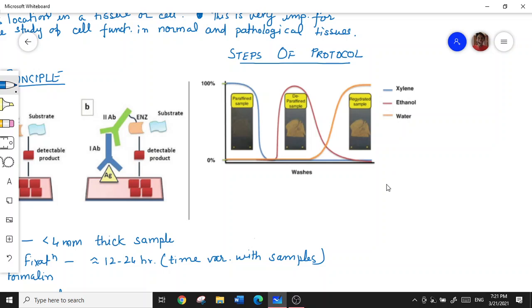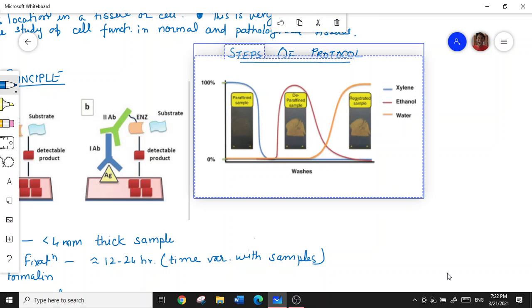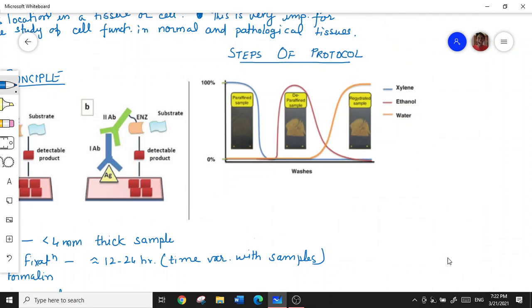So this is how we can check the presence of antigens, which are species specific, lineage specific, strain specific, and their presence in the tissue itself can be followed. This is required to find out before starting our experiment. We need to know on which sample or on which stem cell we are going to work.